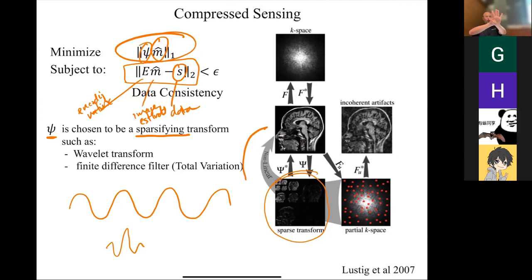And then, if you have moving images, if the background stays the same and only something is moving, then you only have to encode what's moving. So there are just a lot of tricks that people have come up with over the years.